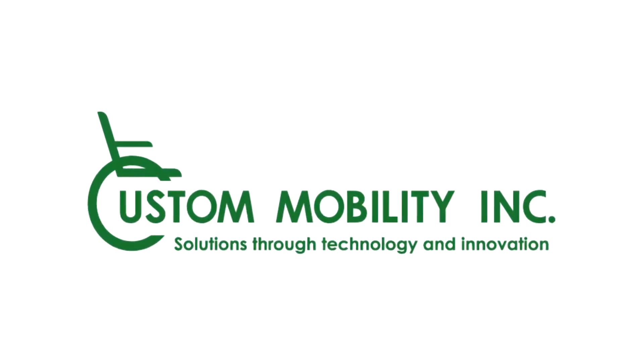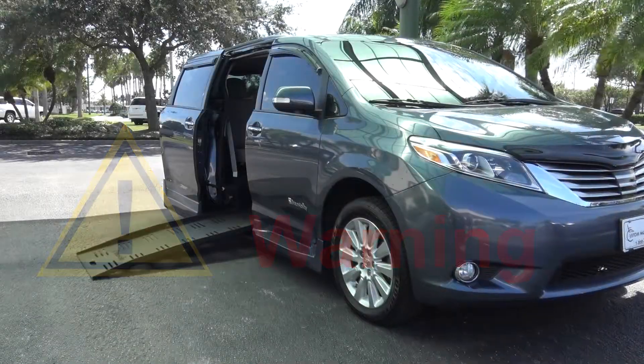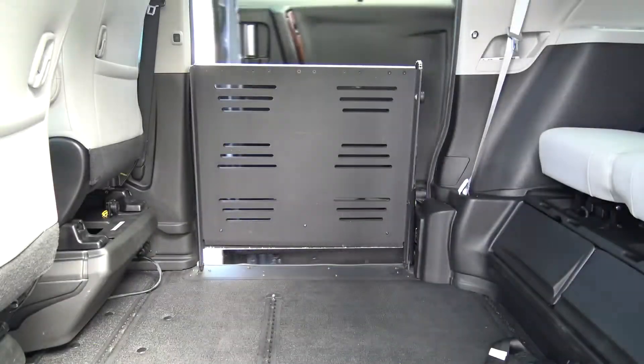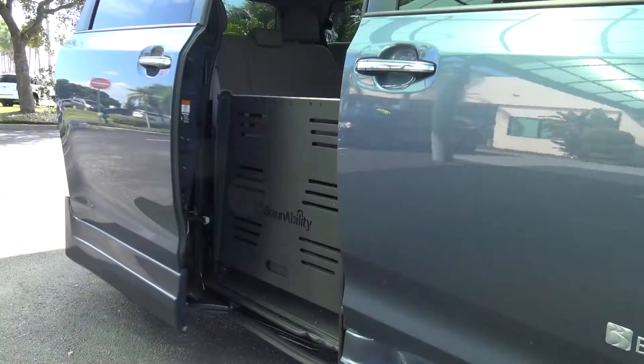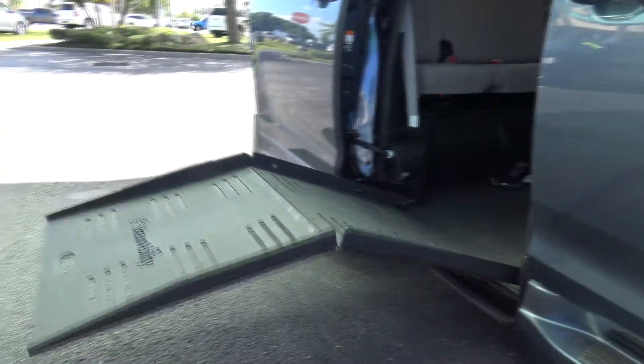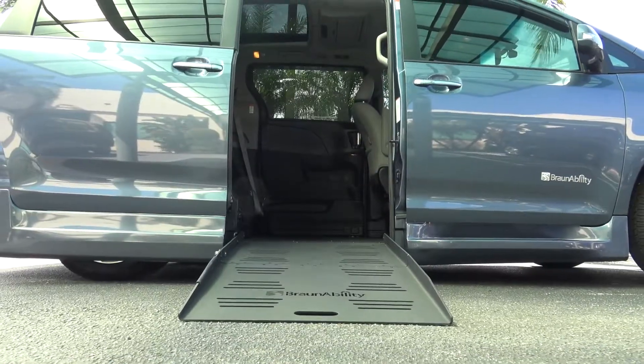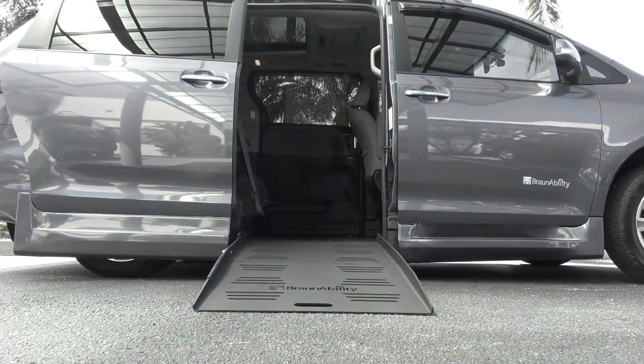Welcome to another custom mobility how-to video. When attempting to either manually deploy or stow your ramp, if it requires too much force or effort or it seems unusually stuck, it may mean there is a problem with the motor. In this situation, it is not advisable to continue deploying the ramp manually and you will need to call for roadside assistance.